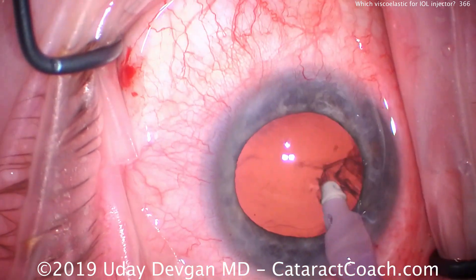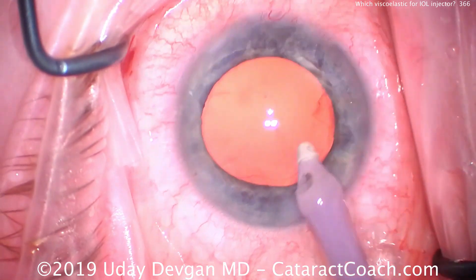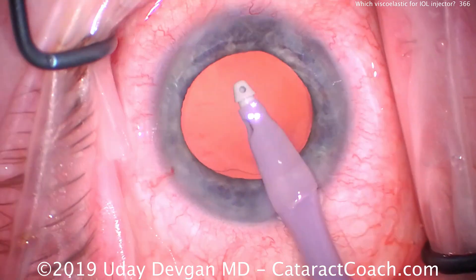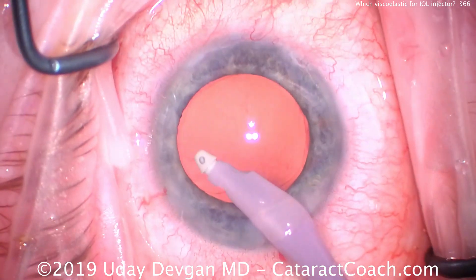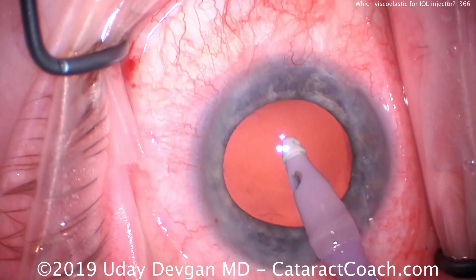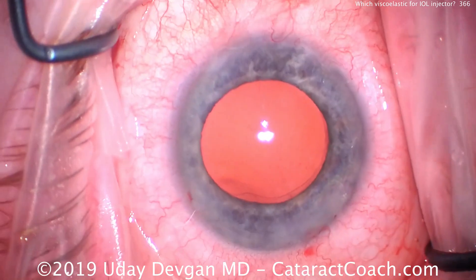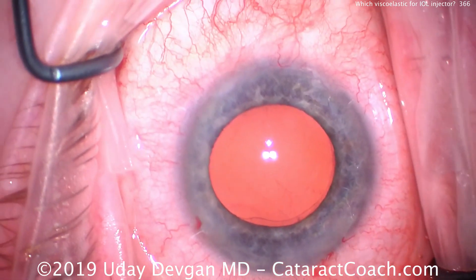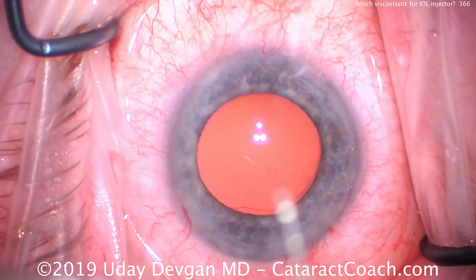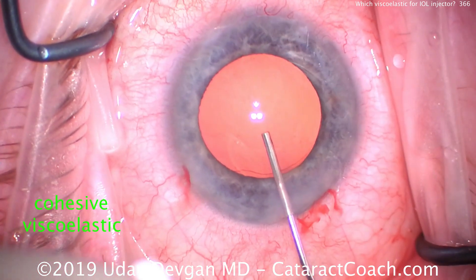For the injector, I tend to use a dispersive agent because the advantage of the dispersive is that it lubricates better — it's a better agent for lubricating the injector. The catch is it's a little tougher to remove at the end of the case, as it tends to adhere to the eye wall surface, so you have to be more diligent in removing it.